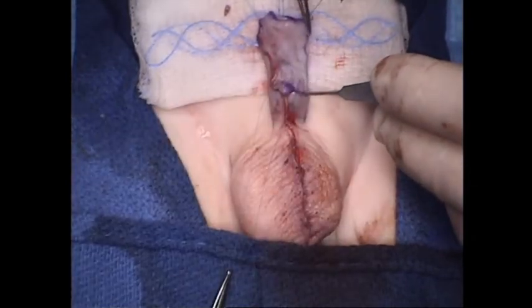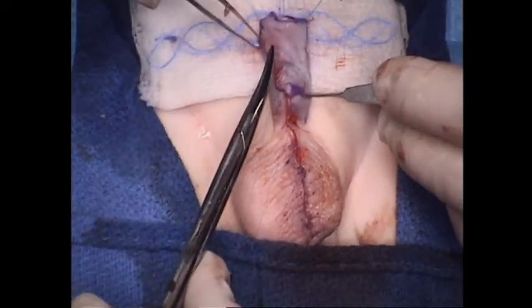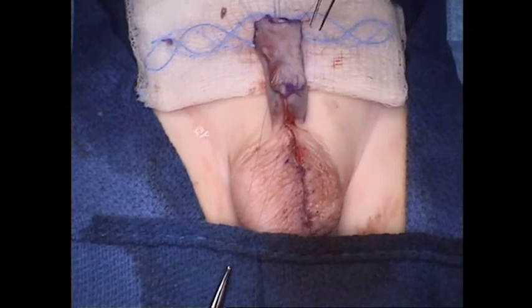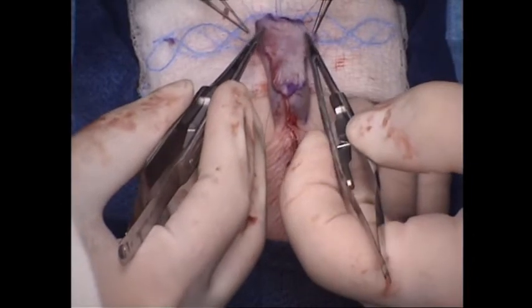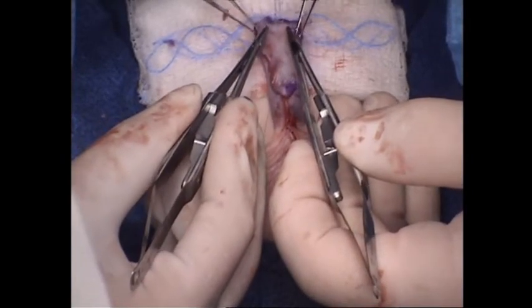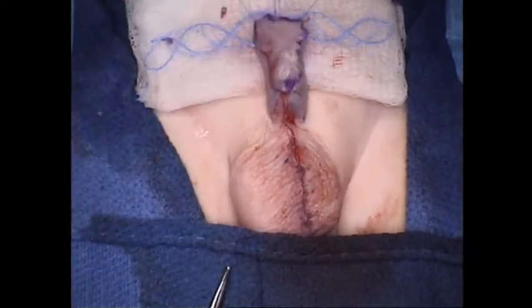So it's only this little tiny corner right here that's sticking out, and just a little bit right here. So we're just going to trim a little bit at a time, and we'll continue to put our stitches in and then trim more as we move along. But what you don't want to do is trim too much at the beginning, because you really want this graft to be laid out nice and wide and flat before you start removing tissues that you may regret.